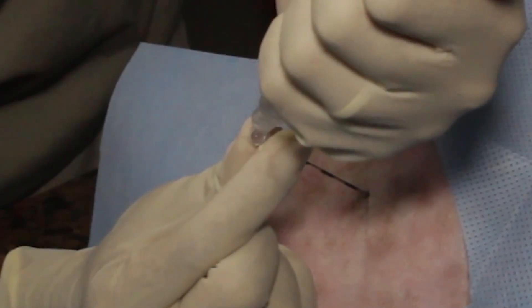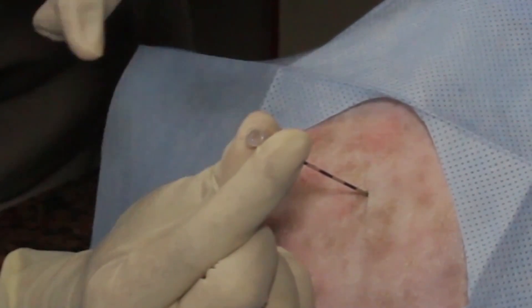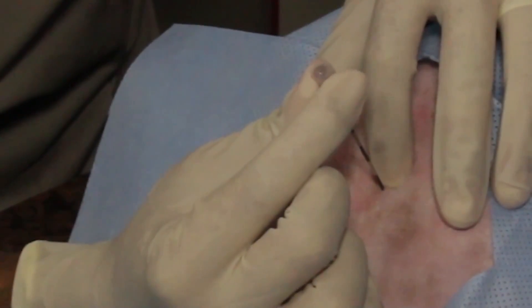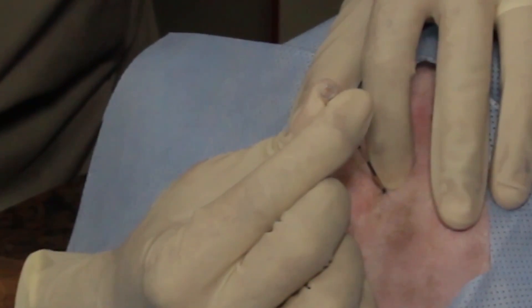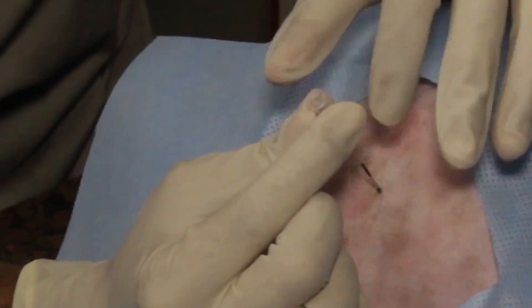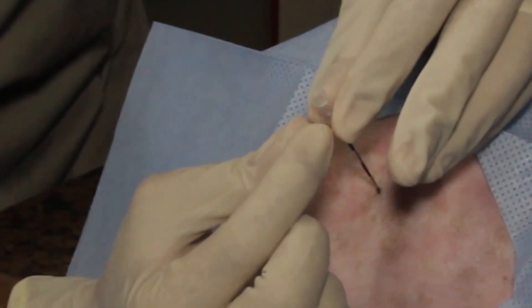The needle is further advanced until there is a loss of resistance felt. At this point, the ligament flavum has been punctured, and the needle is in the epidural space. The puncture of the ligament flavum will produce a marked pop sensation. The drop is usually aspirated into the epidural space because of the negative pressure found within the epidural space. This supports the confirmation of correct needle placement.